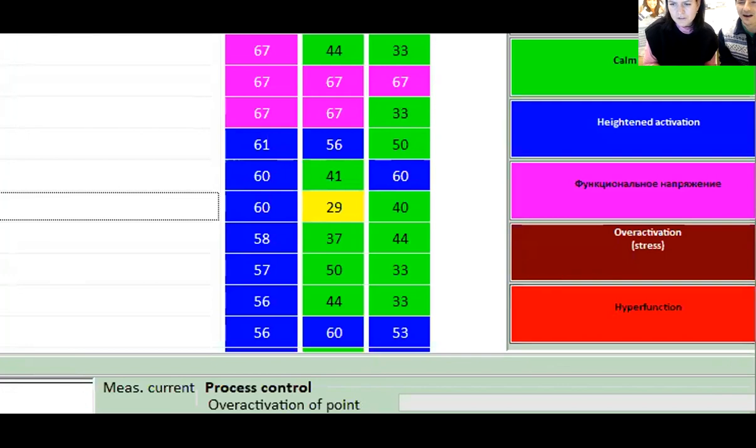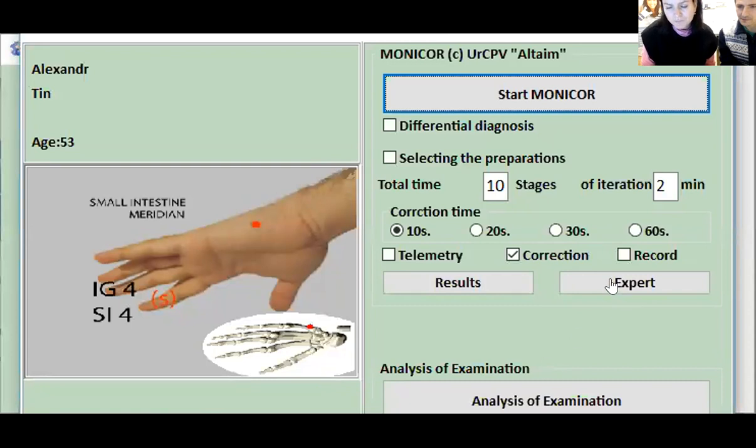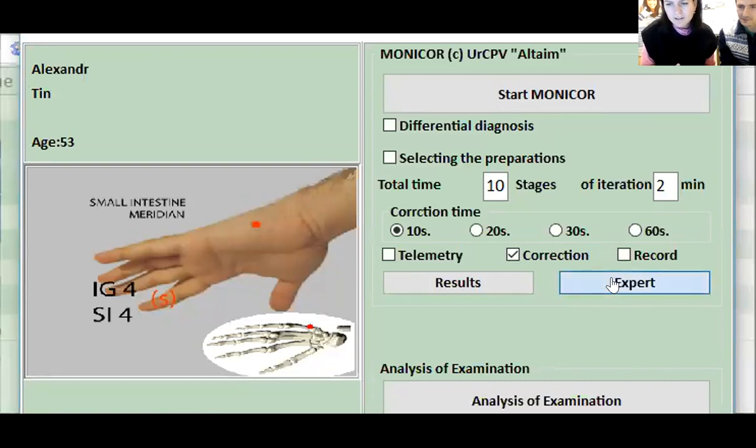So you go through these points. As less the difference, it doesn't matter. But you can see more if you go out from here. You can go to expert. Here you press, and now it's going to show you how the status was. In the beginning he had number 6, then 5, then 4. It means his body is using energy to do the treatment.